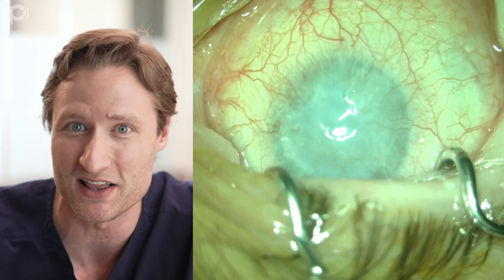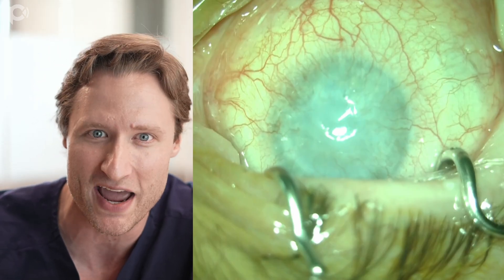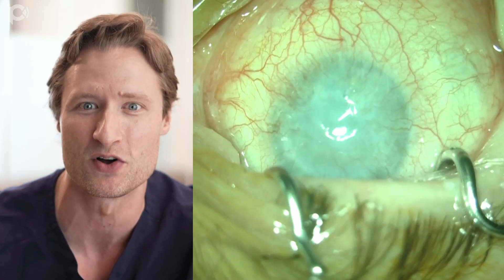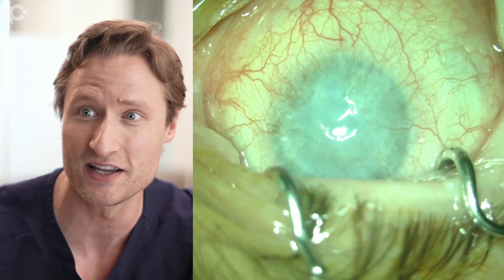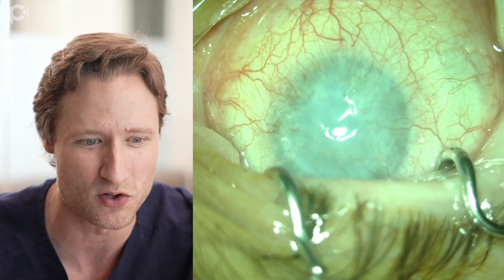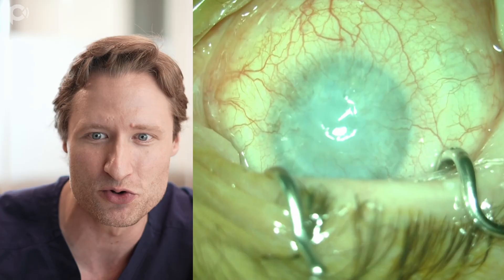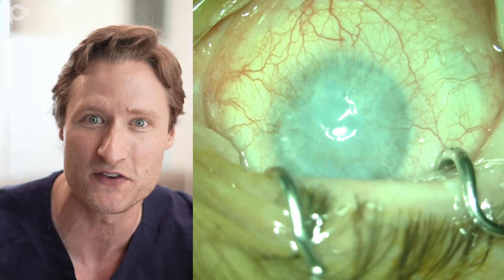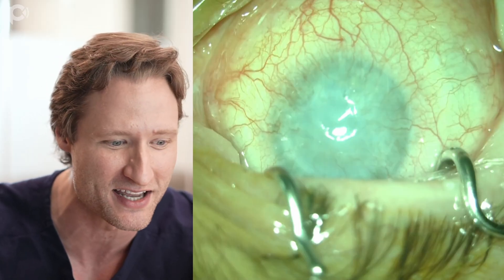But how would you do something like that? Because this is an opaque cornea. When I saw this patient on the operating room table yesterday, my heart sank a little bit - is this operation really possible? I'm going to walk you through how we do this surgery, how DMEK can be done, and what the relevant considerations are for operating with an eye like this.